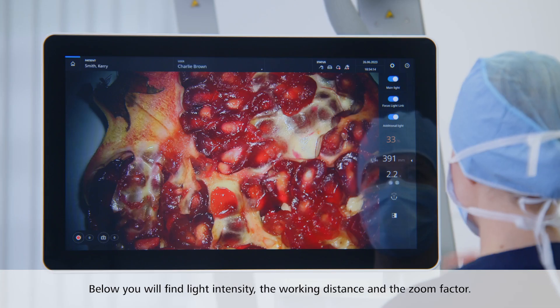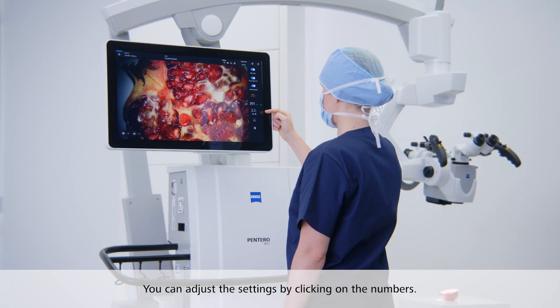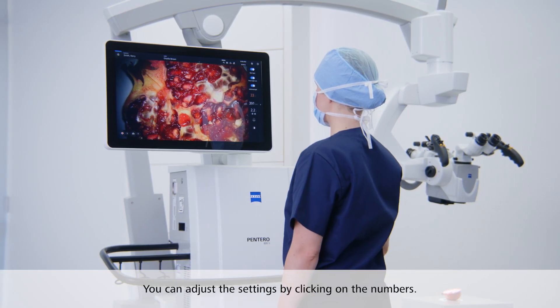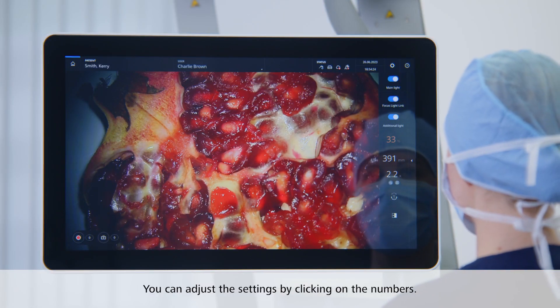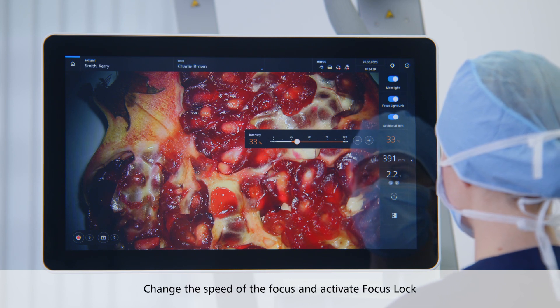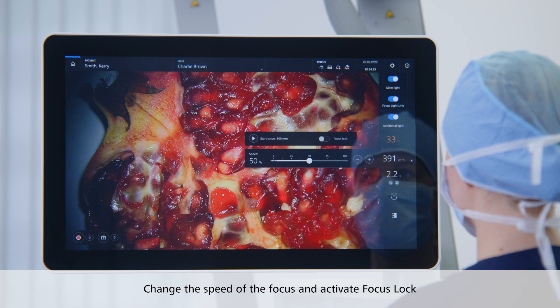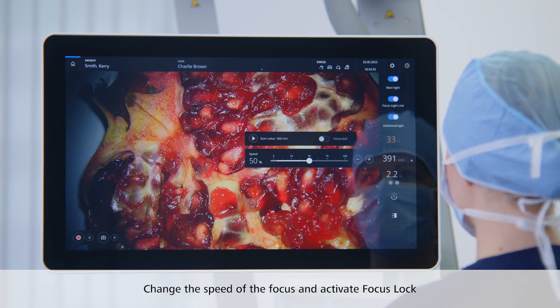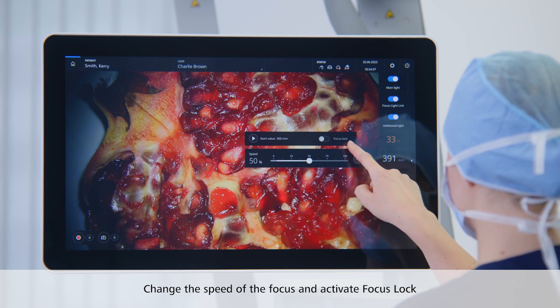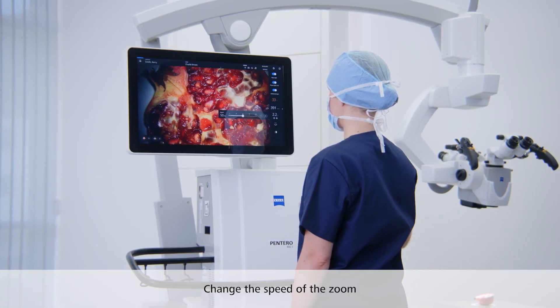Below the switches, you will find some numbers: light intensity, the working distance, and the zoom factor. You can adjust the settings by clicking on the numbers. Change the light intensity by clicking here. By clicking on the working distance, you can change the speed of the focus and activate focus lock in case a micromanipulator is used. Click the zoom button to change the speed of the zoom.